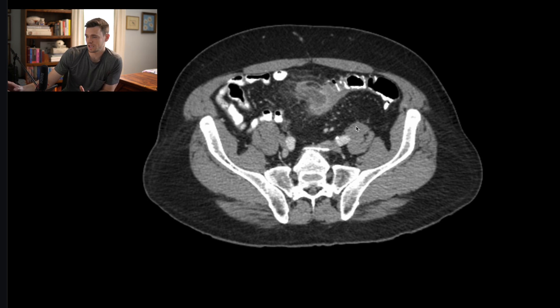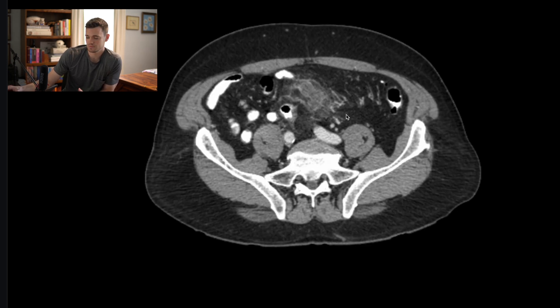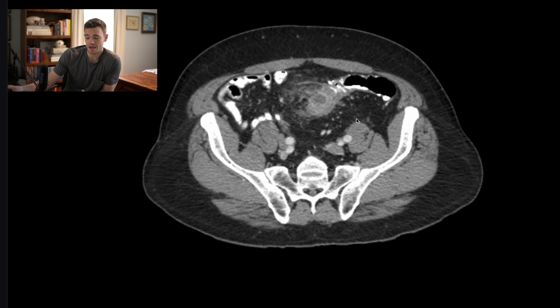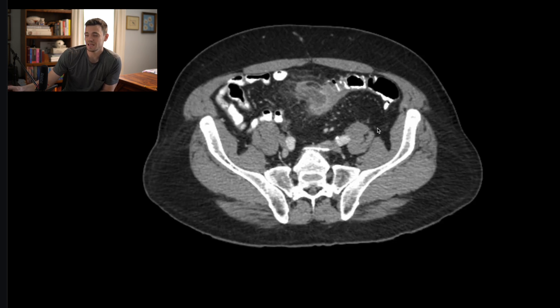If you have diverticulitis that continues — maybe it's improperly treated, not diagnosed, or there's a delay in diagnosis — you can eventually develop a diverticular abscess. That's something that may need to be drained, depending on the size.